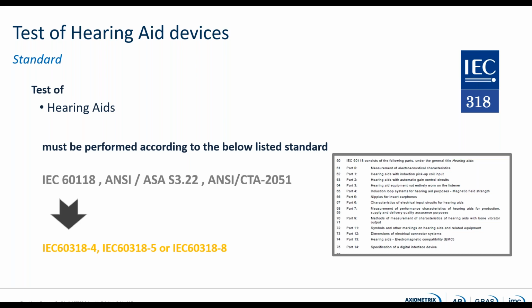All of these standards describe the parameters we are going to measure, the methods, the different tests we have to carry out, and they also describe the tools we have to use when we are doing these tests. When we are talking about the acoustical test, one of these standards will point at the IEC 60318 standard.